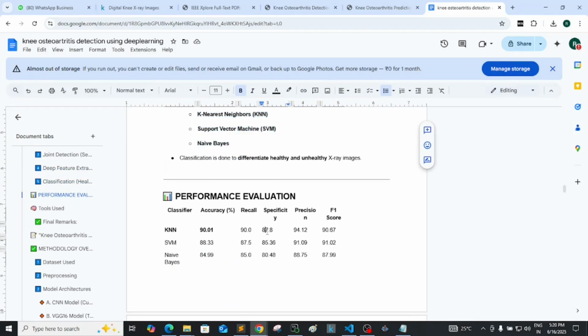for these classes, only 2 classes, remember, they are not going with multi-class. At most, KNN is giving them 90.01% accuracy, even with a very small dataset size. It is not as large as our dataset is. I will be showing you how much data I am using and what we are doing to get such good accuracies.